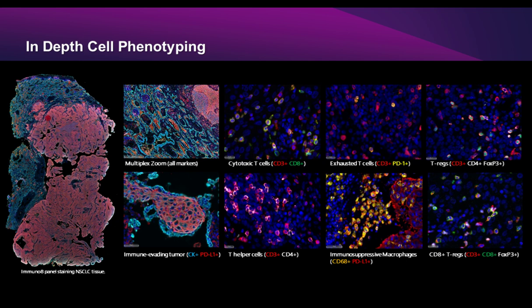Another consideration is that most standard IHC antibodies are derived against epitopes that have undergone specific types of fixation. So sometimes secondary sets of antibodies need to be used in order to optimally stain epitopes within fresh frozen, meaning an antibody that works really well in FFPE may not work as well in fresh frozen.